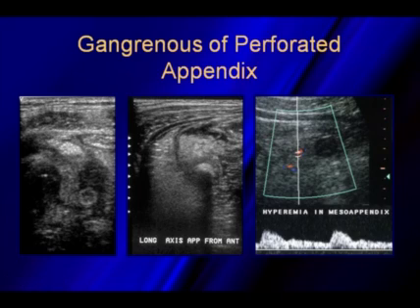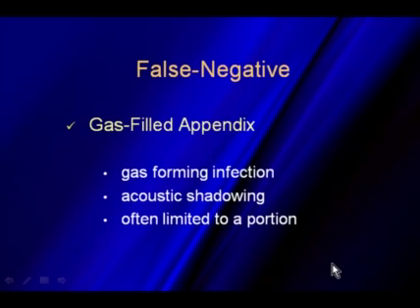But you can see all of this inflammation within it, and scanning around, we were actually able to find what looked like a short axis view of a normal appendix. But here is the appendicolith, and this is the appendix that has perforated, and you can see all of the edema and this big fluid collection, a big phlegmon down there. So make sure that you don't call this a normal appendix because you see what looks like it, but this is typically what a perforated appendix will look like. And you can see that there's increased blood flow within that mesoappendix.